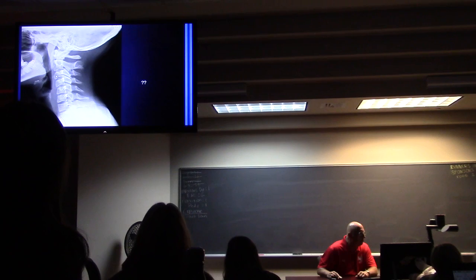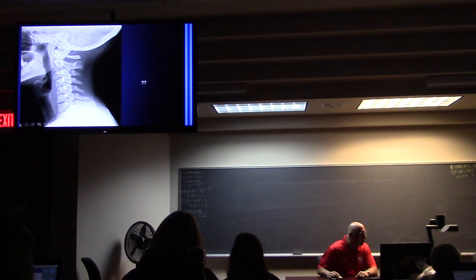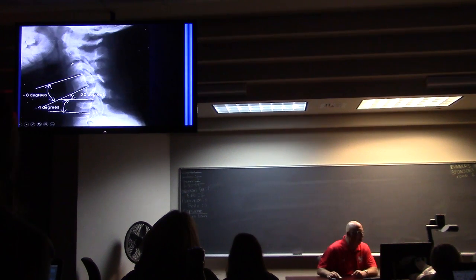Two, three, four, five, six, seven. Anterior line, posterior line, spinal laminar line. Can't see the tip of this spinous process here. Ring at C2 looks good. Soft tissue looks good. Two, three. Soft tissue looks good.